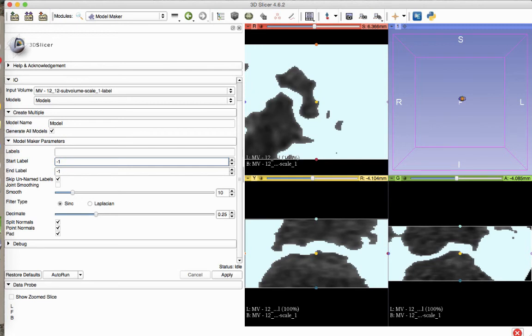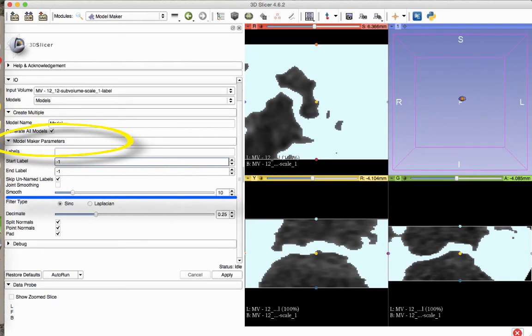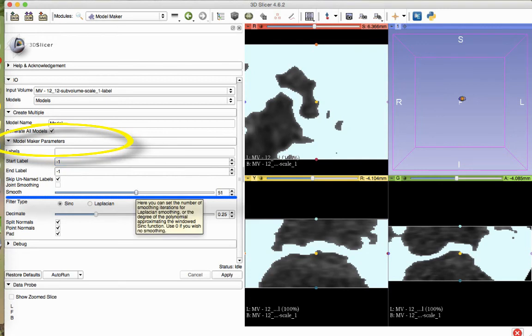You have the option to smooth the model under the Model Maker Parameters button in the Model Maker module. The model can be generated without smoothing if desired. We will apply a small amount of smoothing for this demonstration. Hit Apply to execute the module and generate the model.